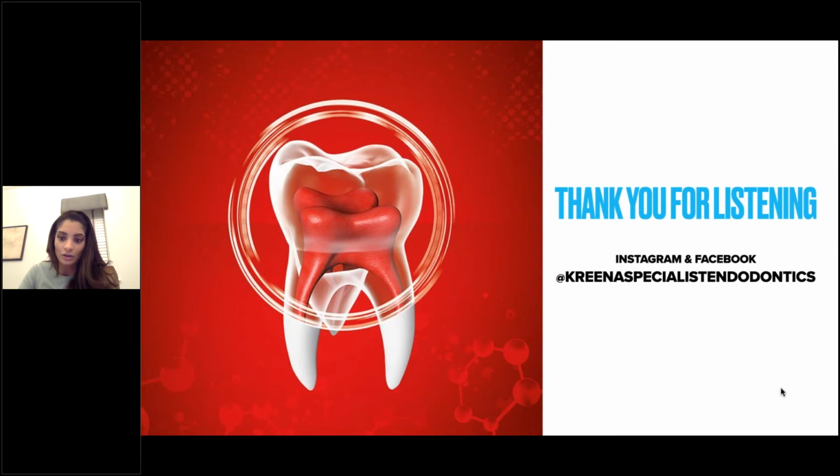Normally with apexification, you put your initial increment in, and I normally check it with a radiograph. You just need to make sure that the procedure is done quite quickly, so you have time to adjust the Biodentine plug if you need to. But yeah, it's a fantastic procedure. It's a fantastic material for apexification.